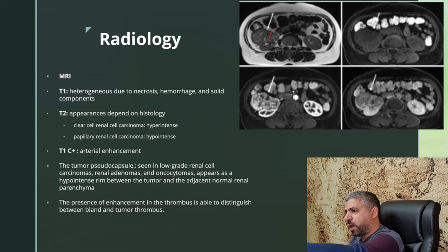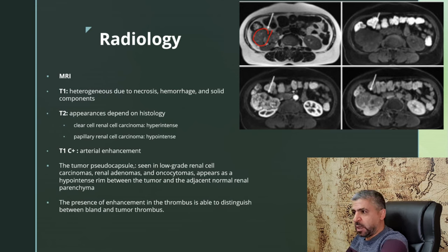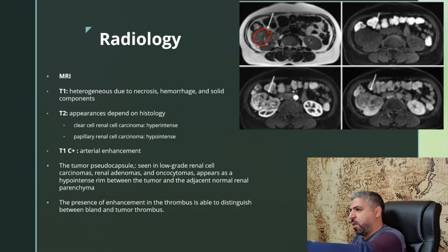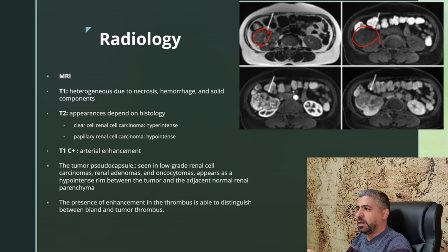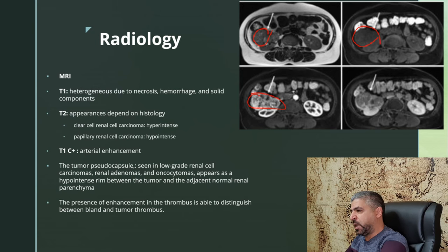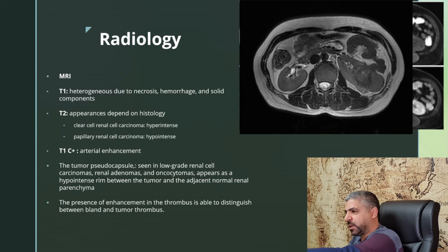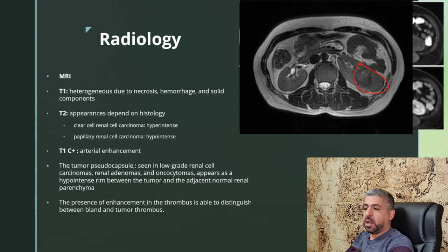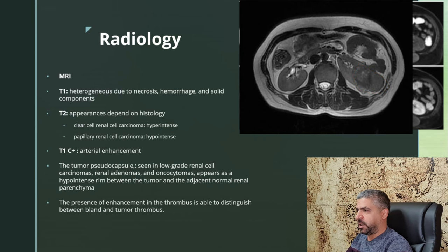In this example, the T2-weighted image shows a hypointense renal mass, making it more likely to be papillary carcinoma than clear cell renal cell carcinoma. On the T1 fat-saturated image it is iso-intense to the kidney, while on post-contrast imaging the arterial phase shows heterogeneous enhancement with some washout at later phase. In another example, the T2-hypointense tumor confirms likely papillary renal cell carcinoma rather than clear cell.